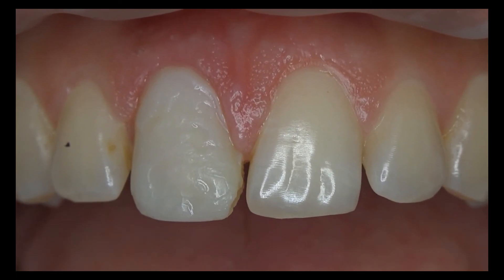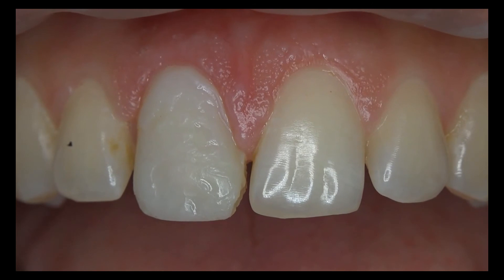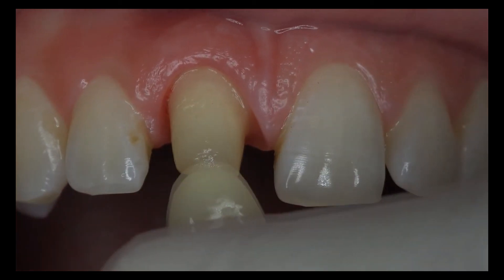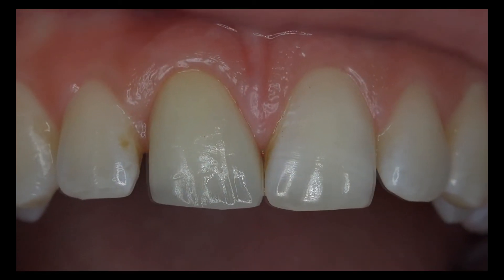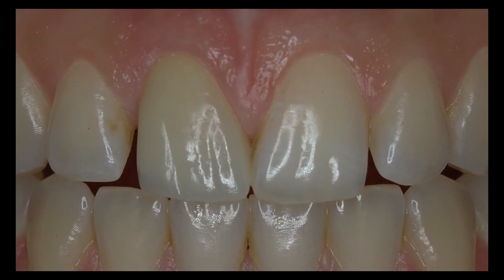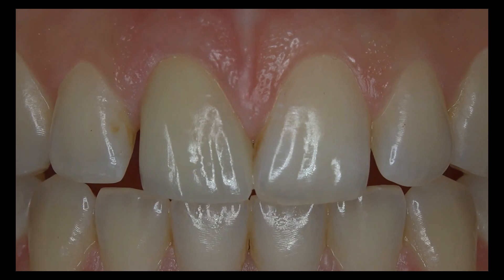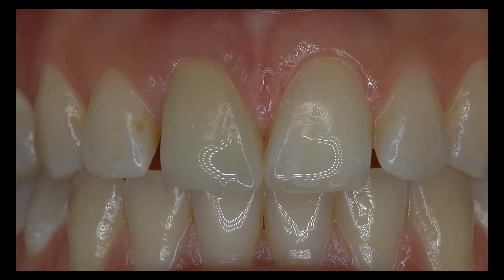Three weeks later, the patient is recalled and the gingiva is symmetrically contoured with the temporary crown exactly fitting at the margin. We fabricate the final crown through a computer-aided design and manufacturing technique after intraoral scanning and lute it with a resin-modified glass ionomer cement. Control is performed immediately after cementation and one month later.